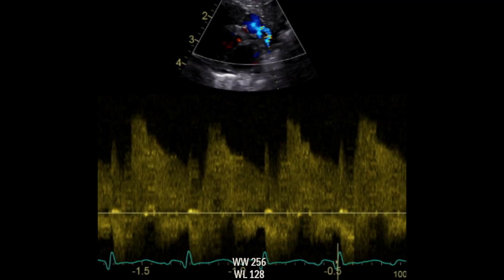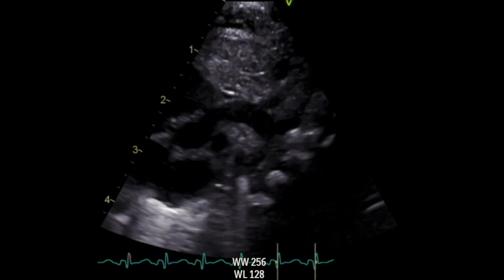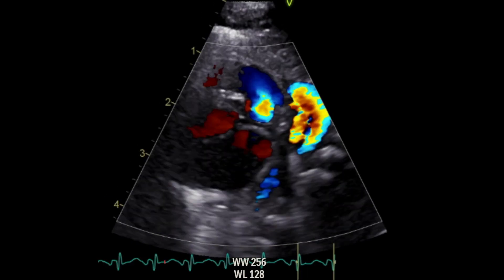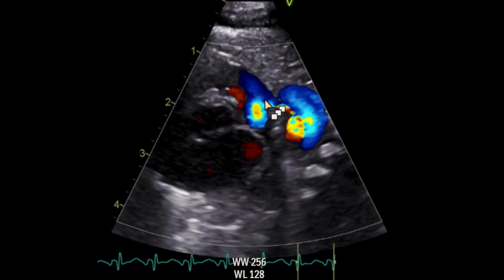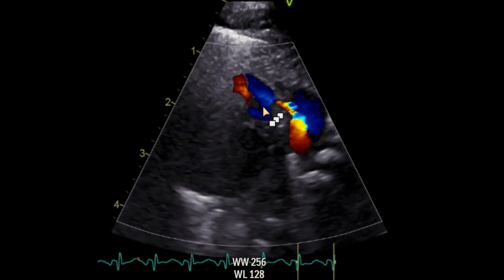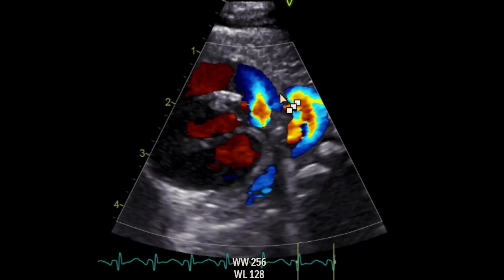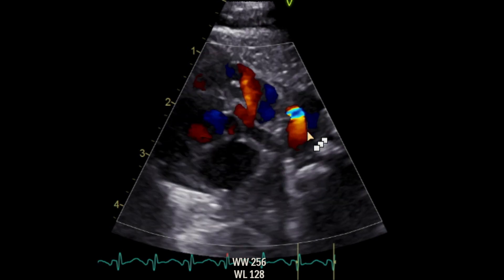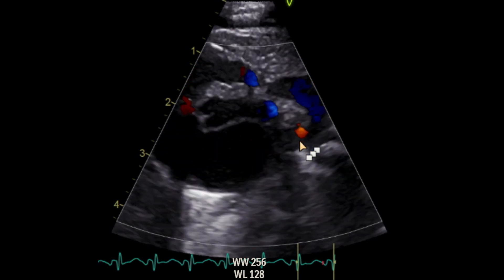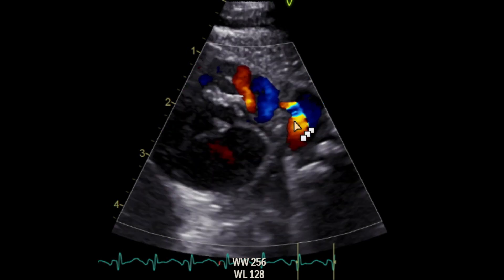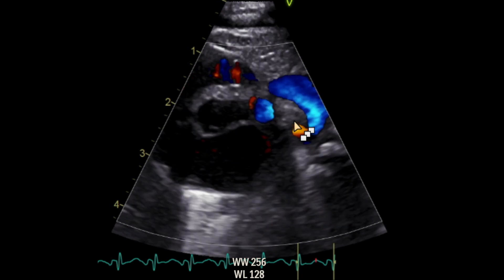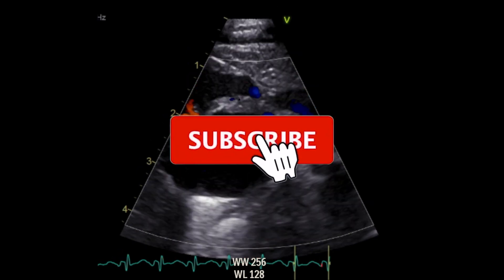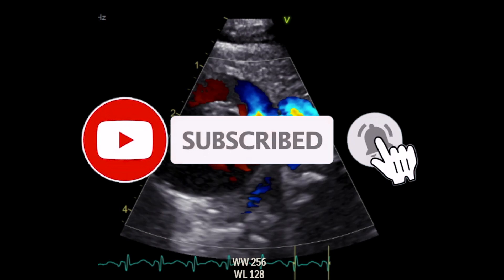And this is the flow Doppler again — the arch view. This is another view. You can see the main pulmonary artery with the descending aorta nicely here, and the PDA — you can see it connecting the descending aorta with the main pulmonary artery.